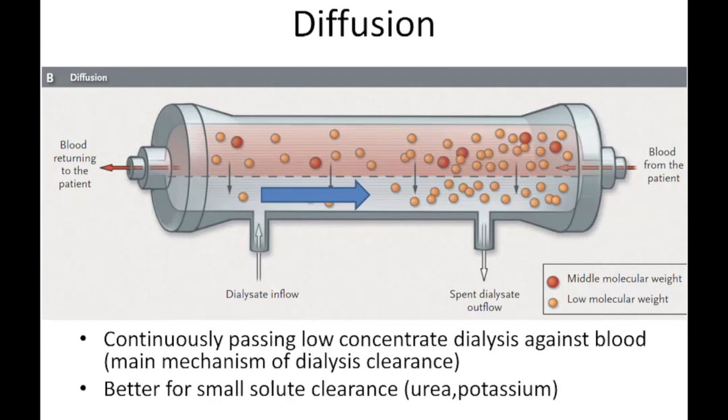it goes in. And as the dialysate proceeds along this line and blood's coming in, the blood encounters the dialysate and urea will begin to diffuse down its concentration gradient. And so as the spent dialysate then goes out to the drain line and becomes effluent, it will leave saturated with urea.